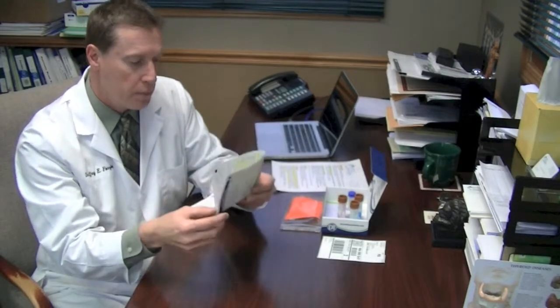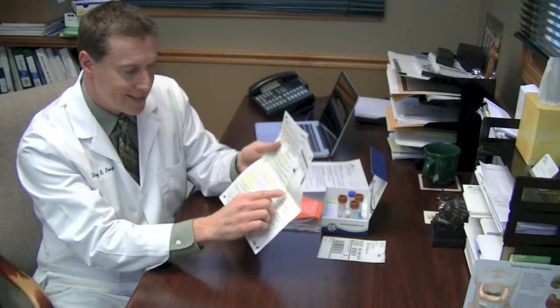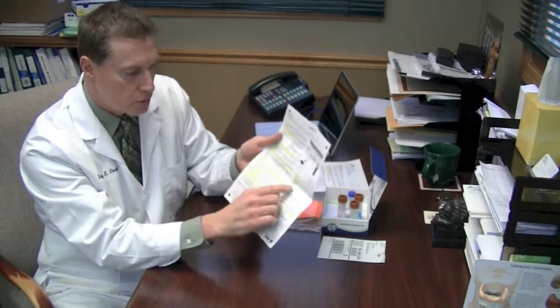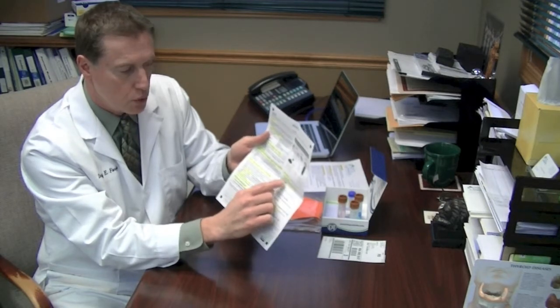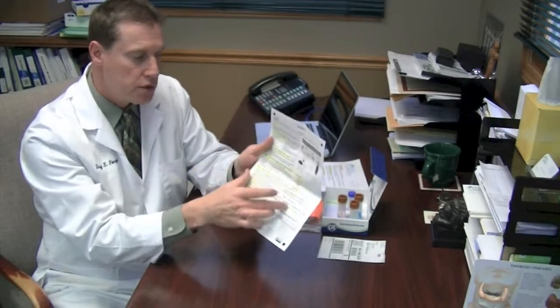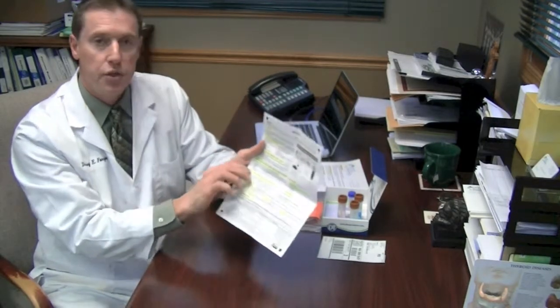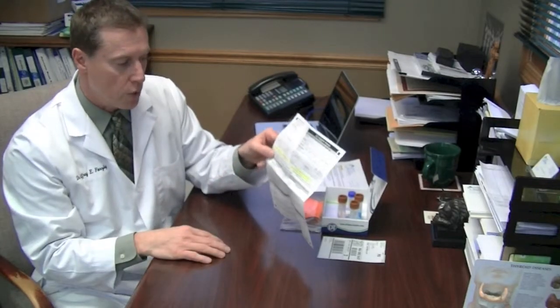When you are done, make sure this is filled out properly. All the areas on here where it says date collected. Also for the stool on the second day, it says please indicate if your stool was dry, solid, soft, or runny. You have to fill that in. All these things on here are highlighted in yellow, so they're easy to see. Again, make sure you list everything on the front as well.